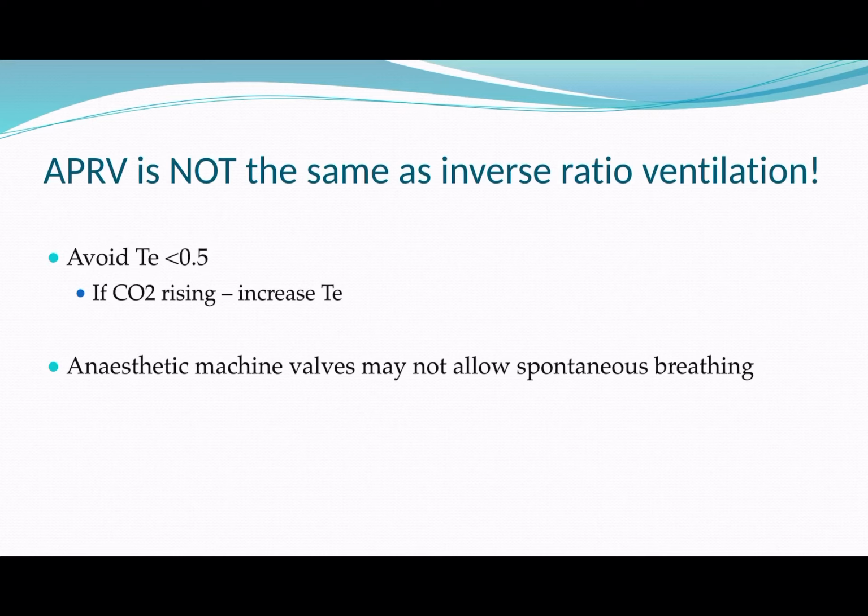Also, the anaesthetic machines may not allow spontaneous breathing. That might not be a problem for you if the patient is paralysed because they're having surgery, but if you're using the anaesthetic machine in intensive care, be wary, because they may not allow spontaneous breathing.